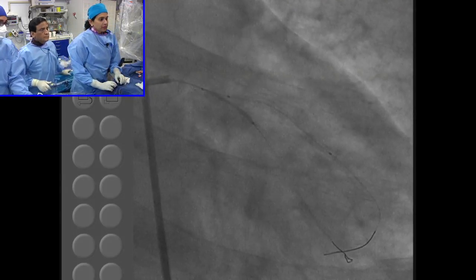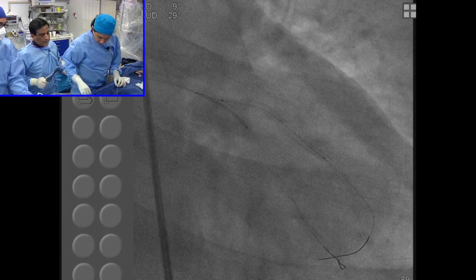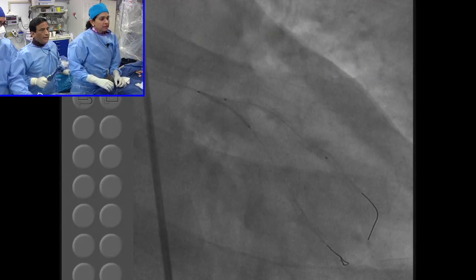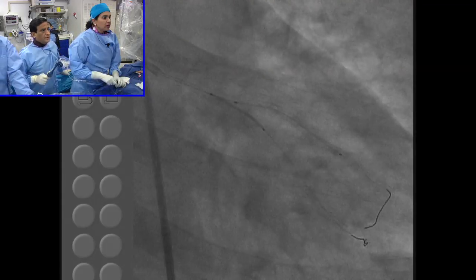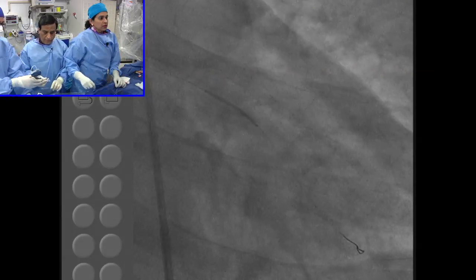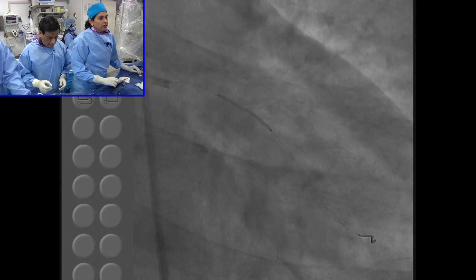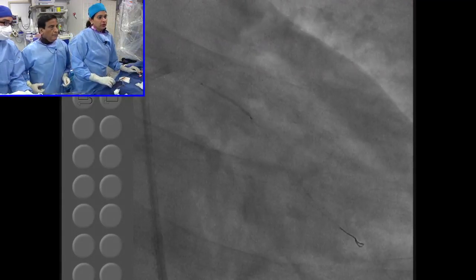So now what's going to happen is the stent balloon and the wire from the side branch will be taken out. Same, the guide can get sucked in. Pull the guide out a little bit. Yeah, there was a controversy even in our symposium. Some people say that they should leave the wire. But once you have a two-stent approach, leaving the wire may cut the wire sometimes, so most of the people will take the wire out once you have a two-stent approach. No, the controversy was only one person, but I think most of the other panel also said that they will take out the side branch wire. Most of the people did say.